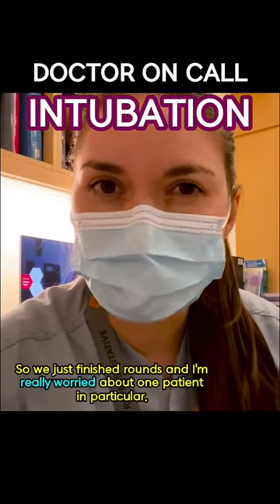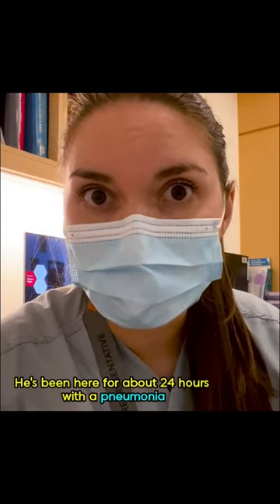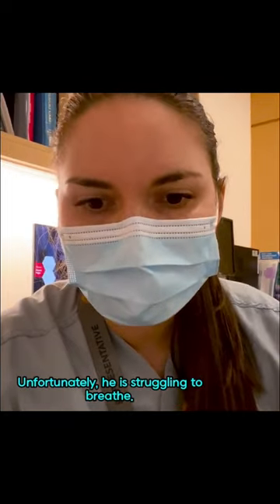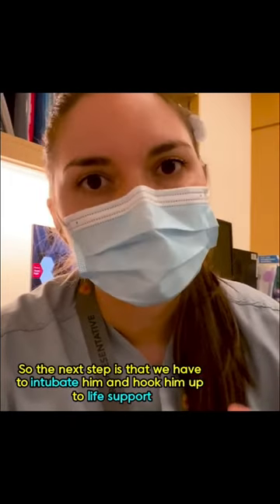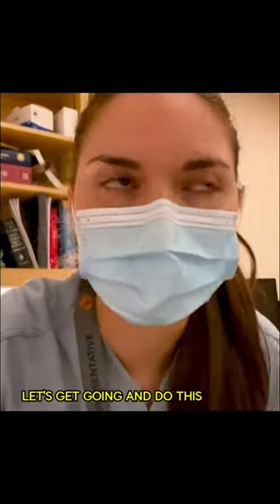We've just finished rounds and I'm really worried about one patient in particular. He's been here for about 24 hours with a pneumonia, but he continues to require more and more oxygen, and now he's on the highest level of oxygen. Unfortunately, he is struggling to breathe — his muscles are working so hard and he's starting to get tired. The next step is that we have to intubate him and hook him up to life support. Let's get going and do this.